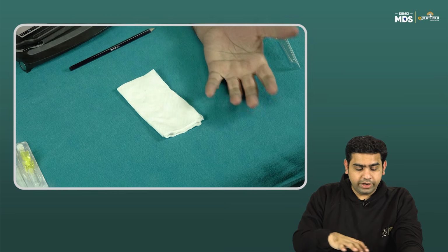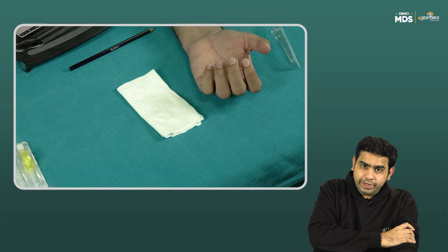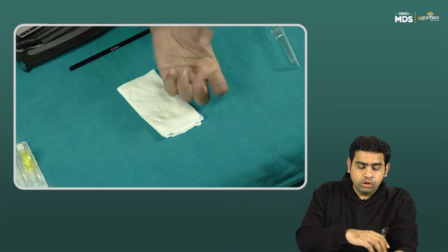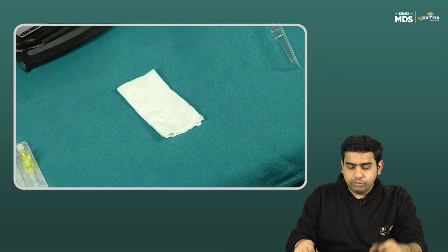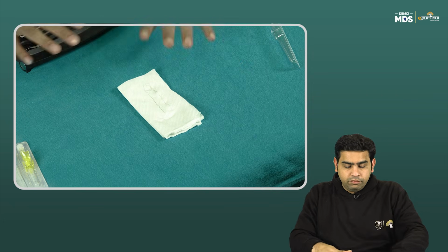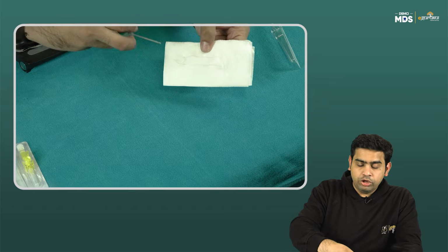So once you have trimmed the hairs, you can apply a tourniquet over here, and you ask the patient to close and open the wrist again and again. What this is going to do is make the veins prominent. So let's assume that this is the arm of the patient and this is the vein which you are having. Now the vein is prominent in front of you.